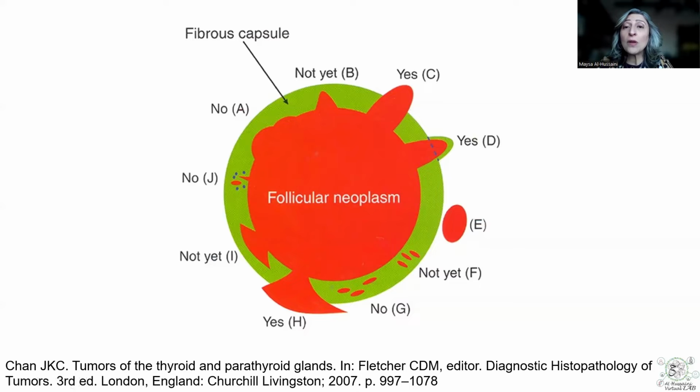But this is not the only scenario, because similar to our case, this protrusion or penetration of the capsule can have this pointy appearance rather than the mushroom-shaped appearance. And in certain occasions, a pseudo-fibrous capsule might form at the advancing edge of the penetrating component of the follicular tumor. What we do then, we draw an imaginary line between the two outer ends of the capsule.